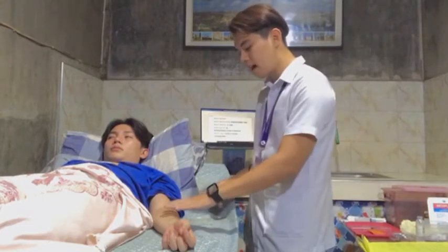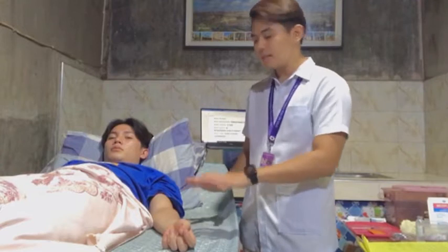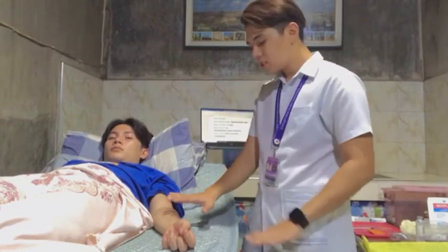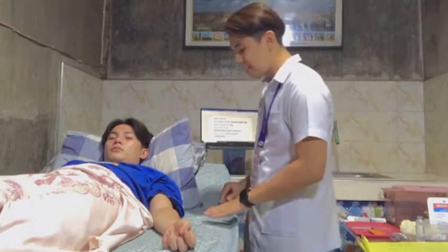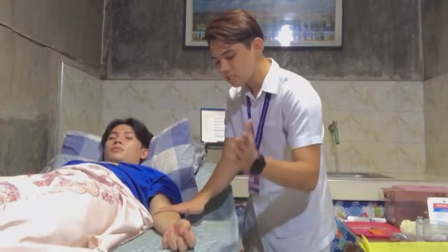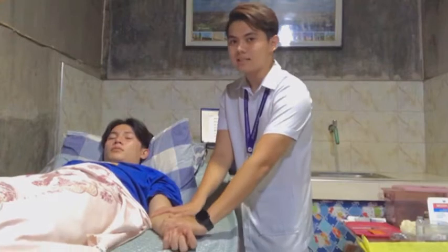So now, choose an injection site free from lesion and discoloration. The site for intradermal is the forearm, because the forearm is a convenient and easy location for introducing an intradermal injection. In general, the site is 3 to 4 finger widths below the antecubital space. The antecubital space is here, then 3 to 4 fingers. And so next is 1 whole finger or 1 hand above the wrist, and these will be the sites.